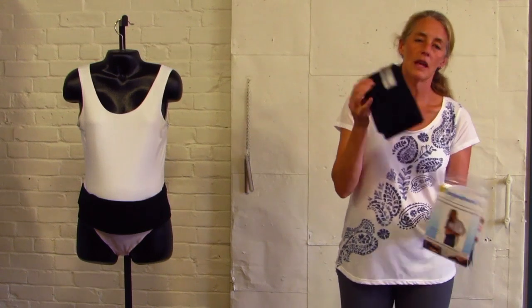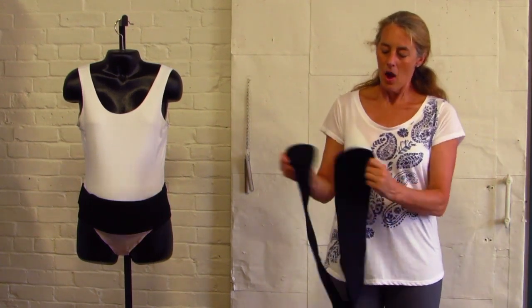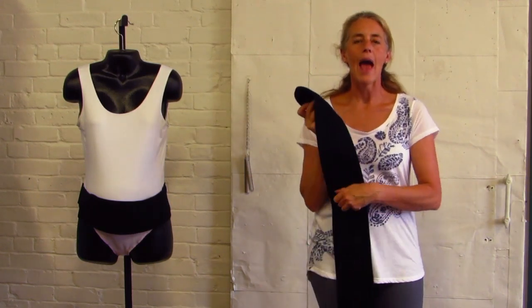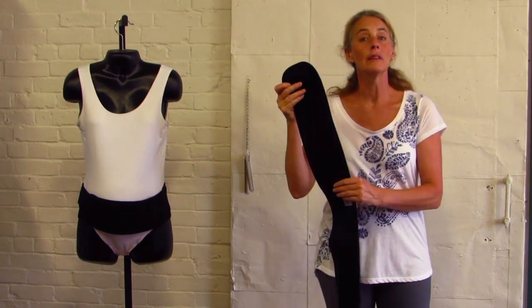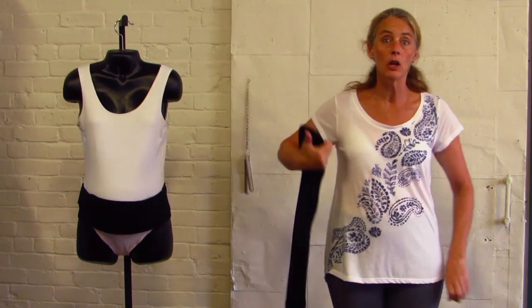So the first thing you're going to do is take your Baby Belly Band out of its package. On one side is the label, and on the other side is an add-on elastic support piece that gives an increased lift to the Baby Belly Band. It's an optional piece that can be removed if you don't need it.